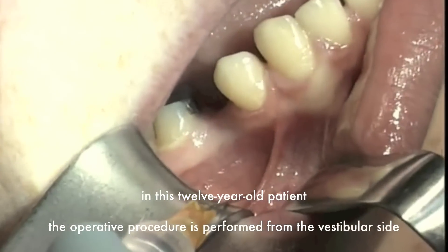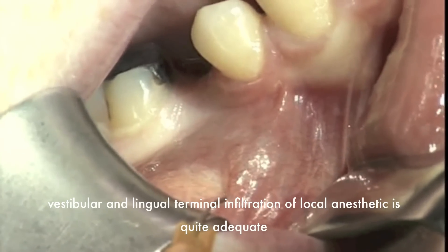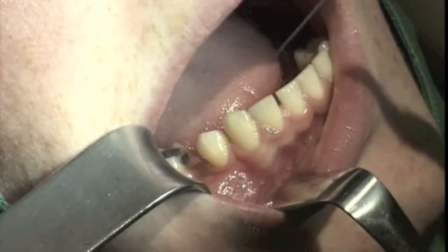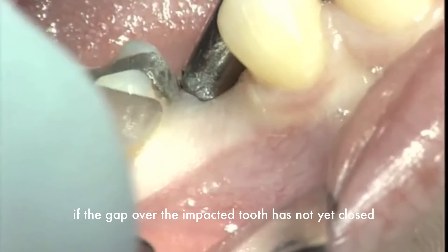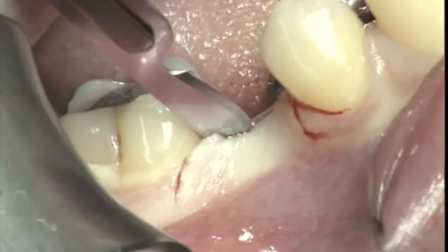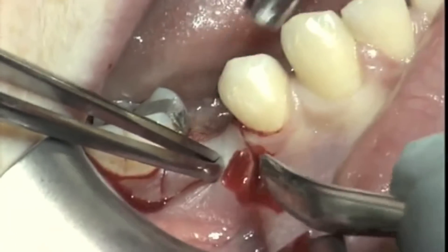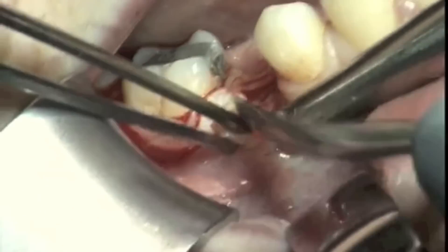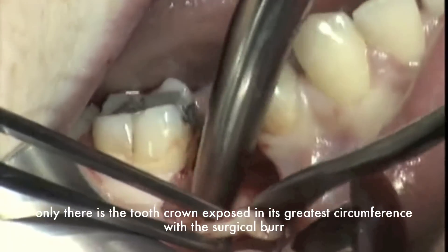In this 12-year-old patient, the operative procedure is performed from the vestibular side. Vestibular and lingual terminal infiltration of local anesthetic is quite adequate. If the gap over the impacted tooth has not yet closed, the trapezoid mucoperiosteal flap is dissected on the alveolar ridge and vestibule. When elevating it, the mental foramen should be exposed carefully. Only then is the tooth crown exposed in its greatest circumference with a surgical burr.